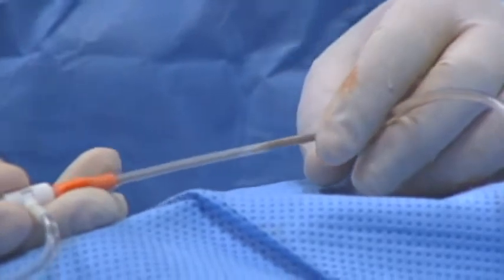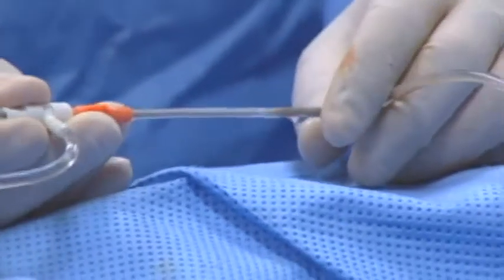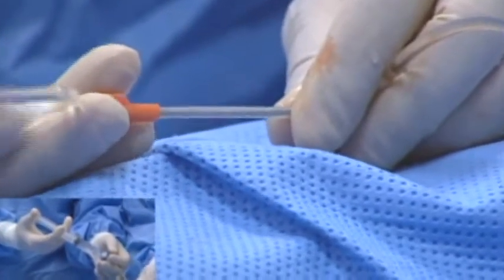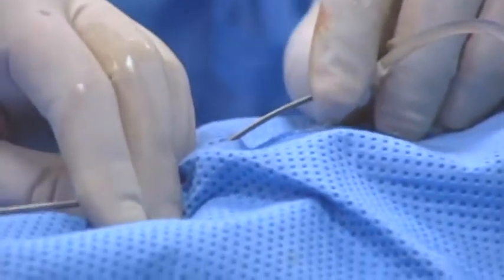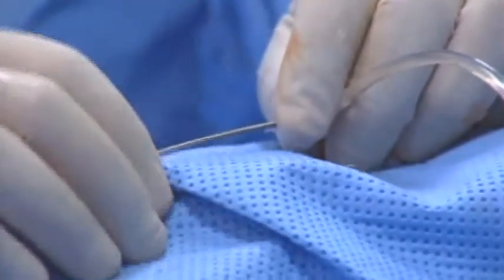Let me show you that later. While I flush, Raul is just transferring, pushing the loader there. I'm doing a gentle flush. Go ahead, Raul. Yeah, so no resistance at all. No resistance, perfect. So it's being loaded, and Raul is going to advance the system. Let's go, Angel, please.